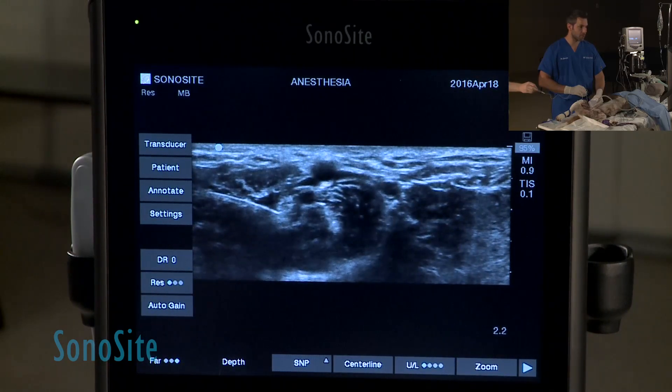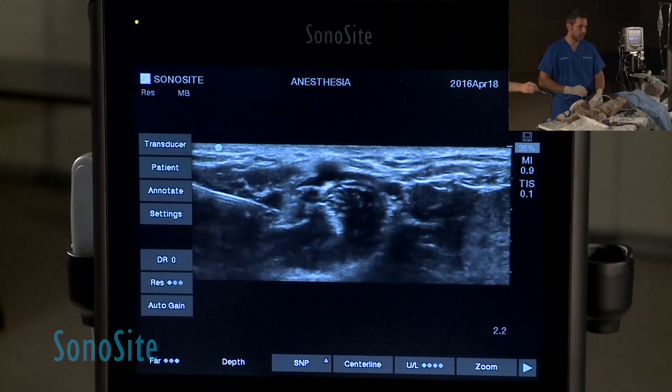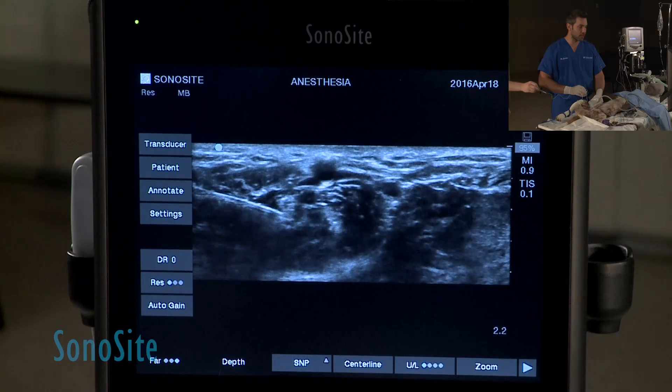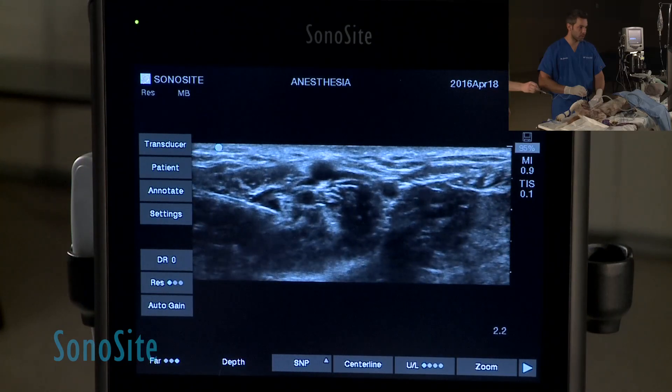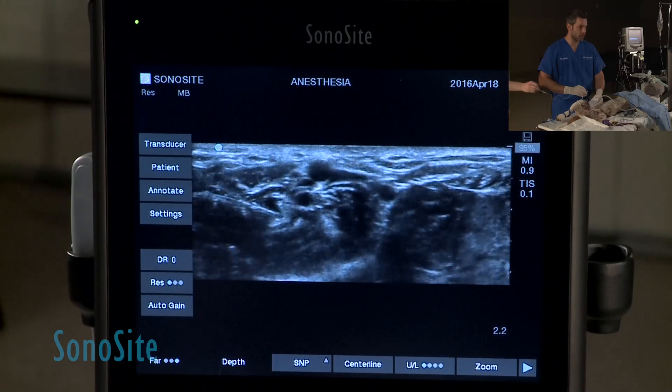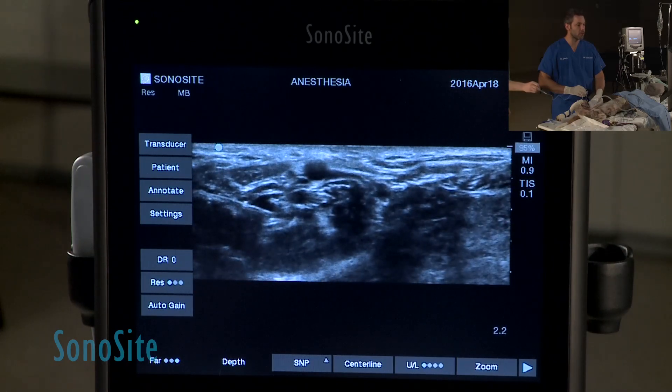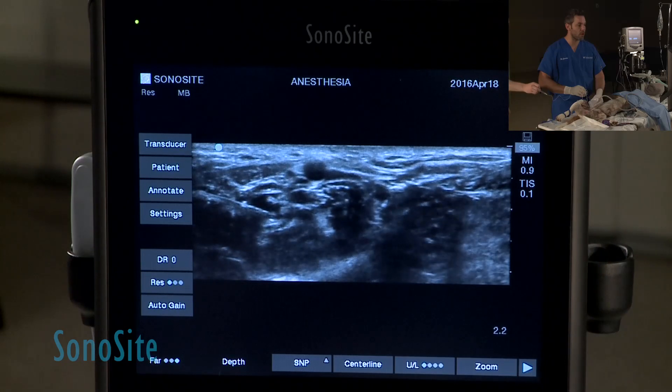We aspirated to make sure we didn't hit that circumflex, and we're going to coat now the nerve with the local anesthetic. You can see we're creating a pool of local anesthetic around the nerve, which will make the nerve a little easier to see, and you're going to see that now the nerve is quite a bit detached from every structure around.